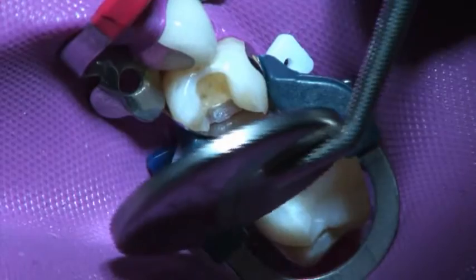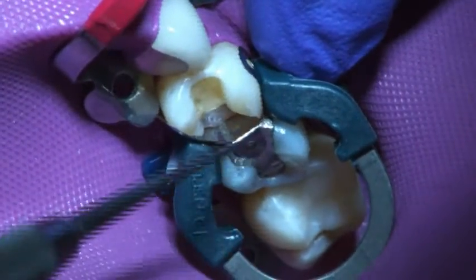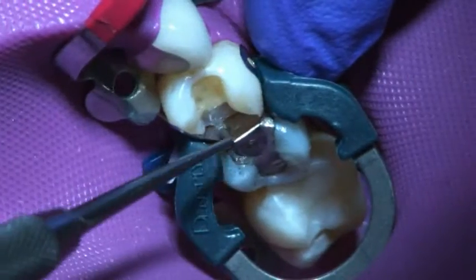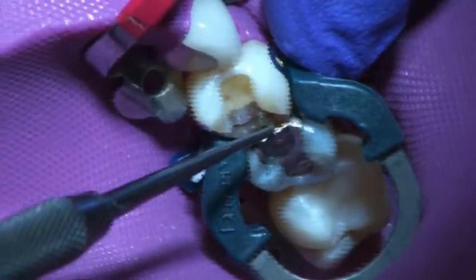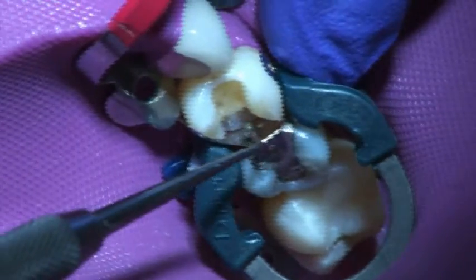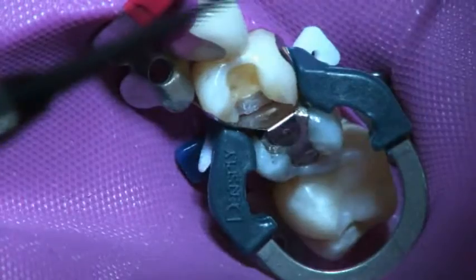Now we'll verify and burnish the contact area. I'm confirming that my wedge is not encroaching, and I can get an ideal contact. My band does not move — it's quite secure, and I know I'll get a good contact. It's so secure, in fact, that I can even replace the wedge if needed.